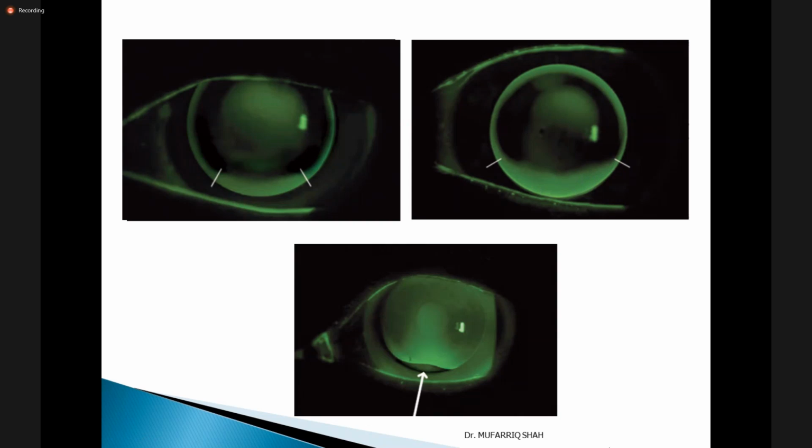So you will need to steepen the periphery at the 6 o'clock. In the third case, the lower one, the edge lift is standing up. If you see, even the space is there and the bubble will go inside. So in this case, you will apply grade 3.